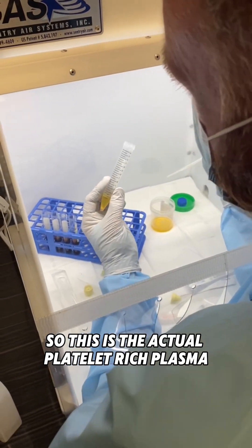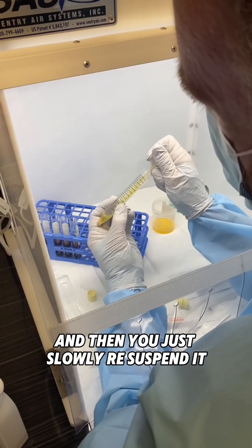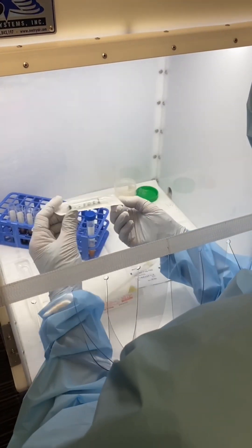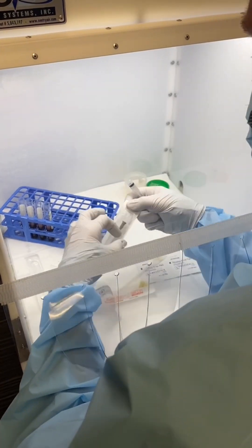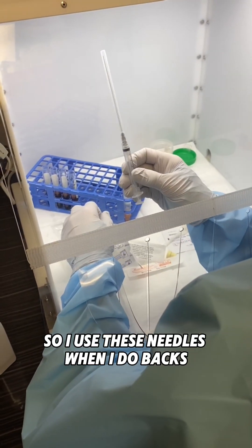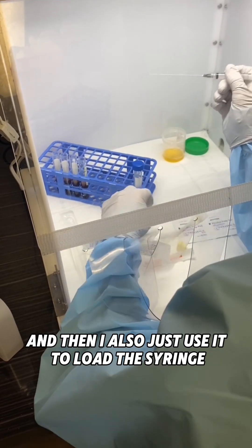So this is the actual platelet-rich plasma, and then you just slowly re-suspend it. I use these needles when I do backs, and also just to load the syringe.